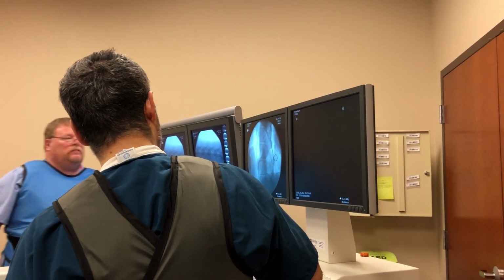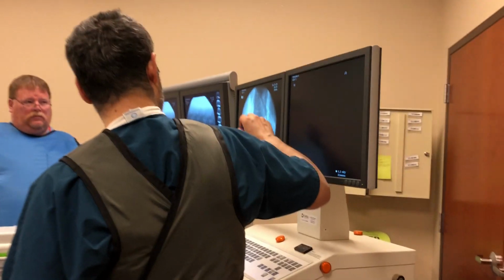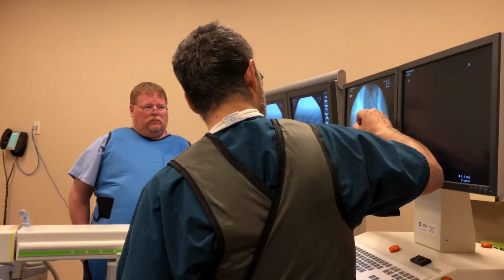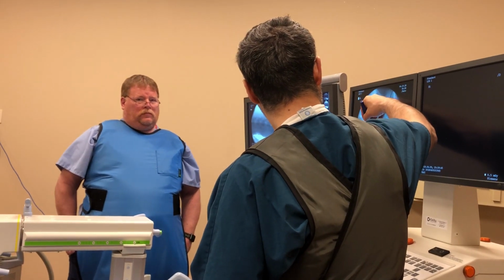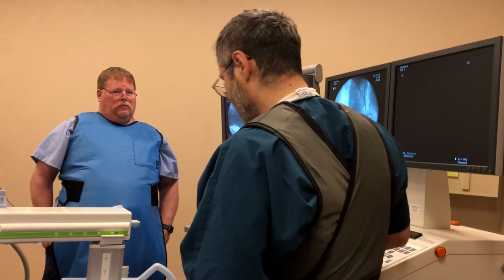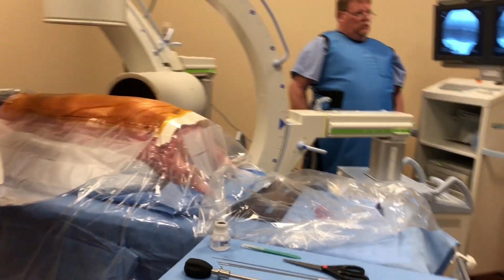For the OLIF part, for the posterior instrumentation there are different considerations, but for the OLIF part, all you care about is that you are able to identify the lateral border of the bone, as well as see the trajectory of the end plates. Sometimes because of the parallax, here you have a good parallel, you see the end plates. But that doesn't even matter.